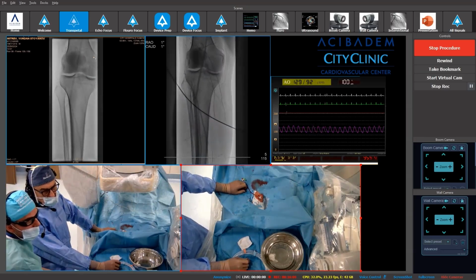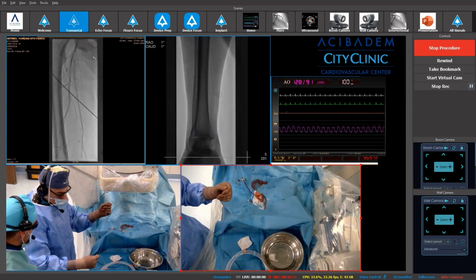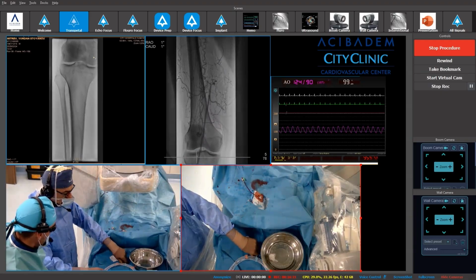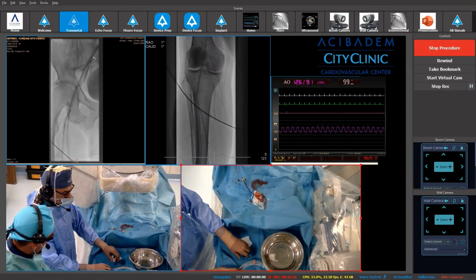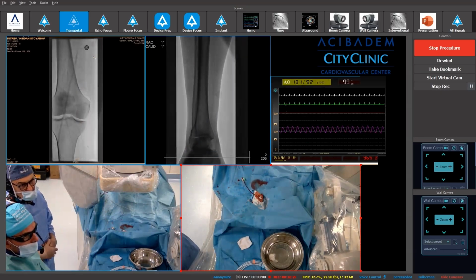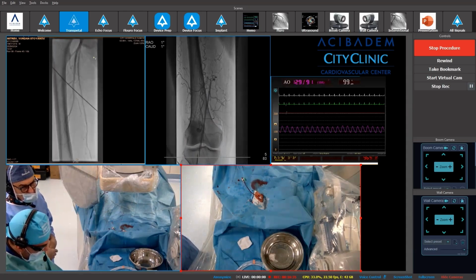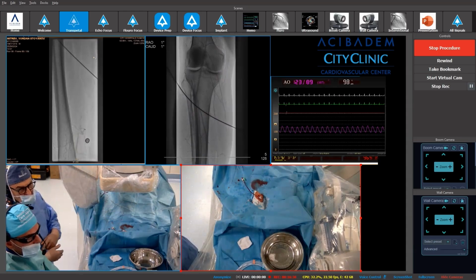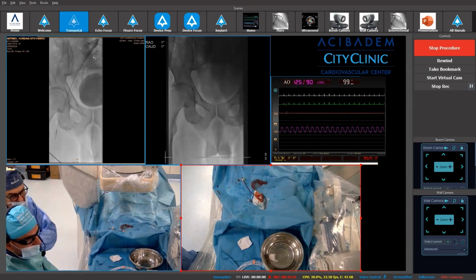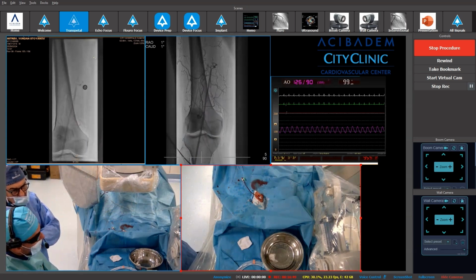My first question was, you're trying to fix all the problems of the patient, coronary and peripheral, in one procedure. What is the reason in the majority of the cases? In fact, we choose the most clinically relevant pathology first, and as a second step, the other pathology. Because in this situation we don't have critical limb ischemia or rest pain, it's in fact an elective procedure that was planned quite carefully.